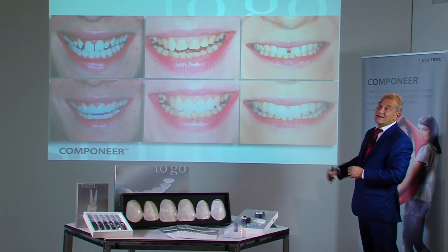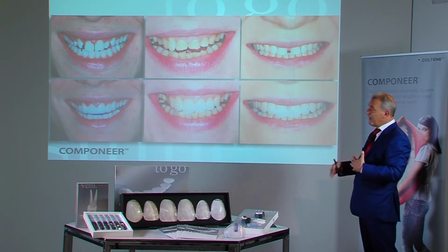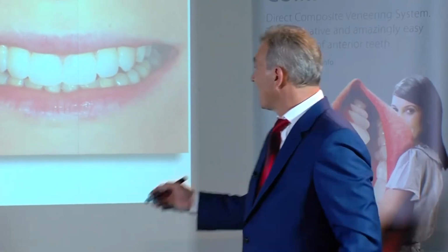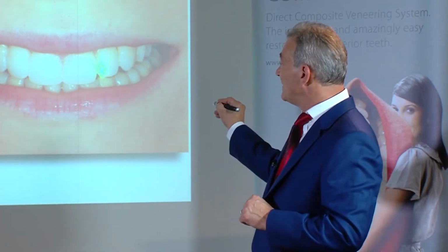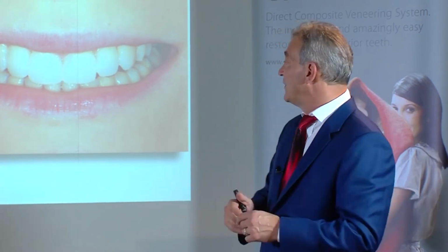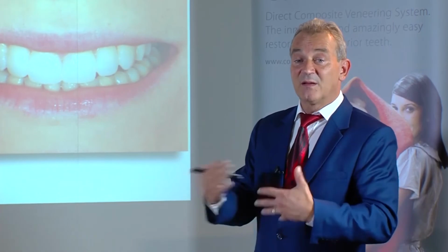At first, one might think that the central incisors would be too large when closing the gap. However, when the teeth are arranged buccally, then I can shift the margin line inward and thus shift the lateral incisors, the margin line, to mesial. This allows adapting the proportions of the teeth accordingly.